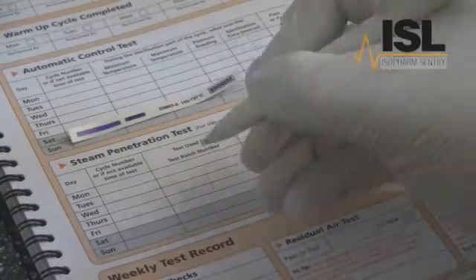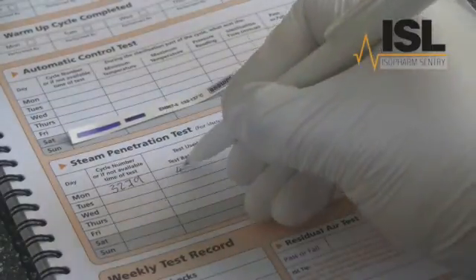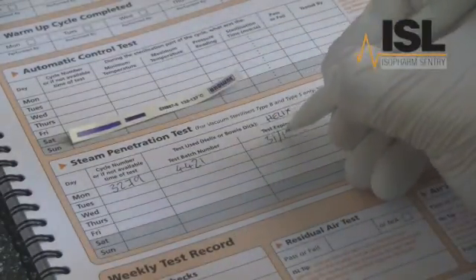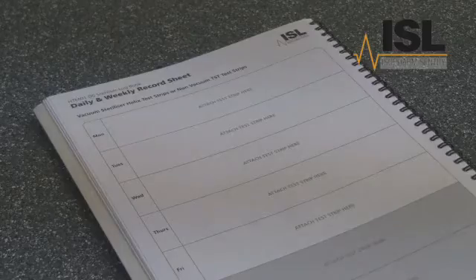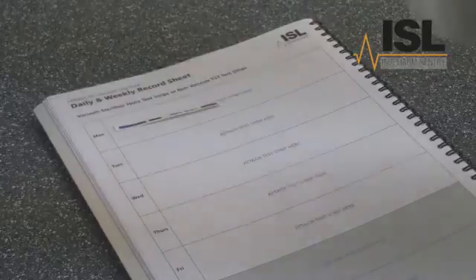After the test, remember to complete the test record in the machine logbook. You should also attach the test strip in the logbook as further evidence of the test result.